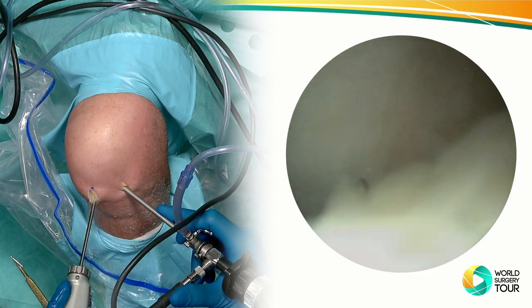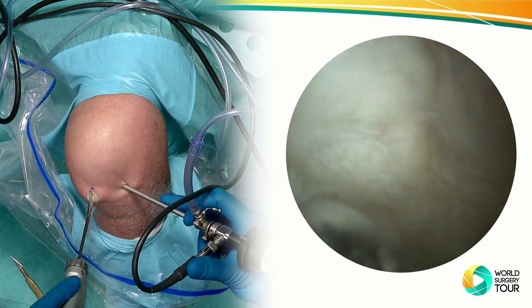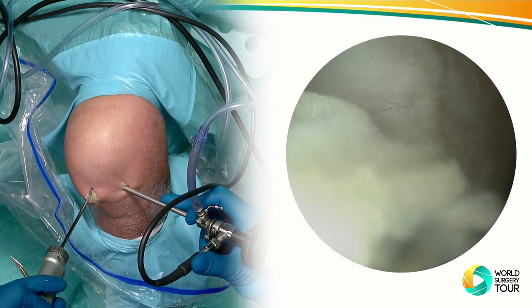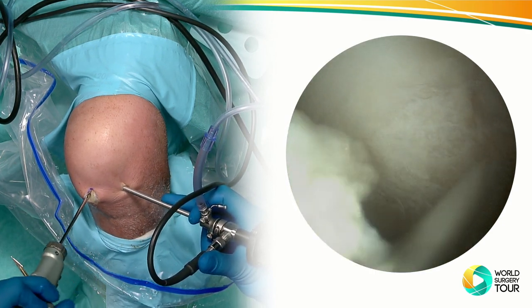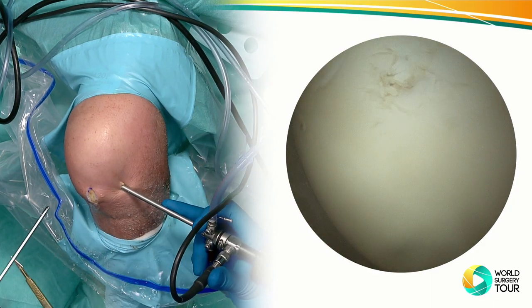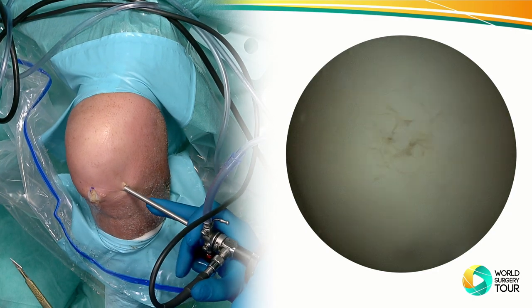So here we go. Take your time a little bit to take the tissue away. It won't take too much time, but a little bit, then you avoid the hassle of having an obstructed view during the procedure itself. All right. Then you have what's called the cartilage punch.